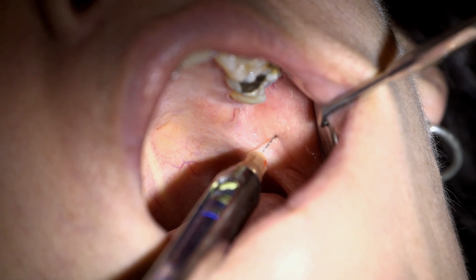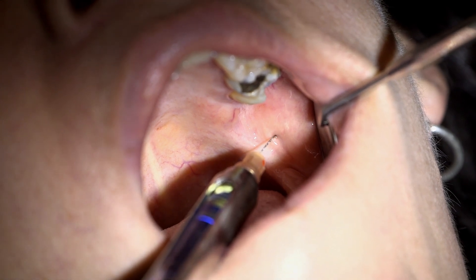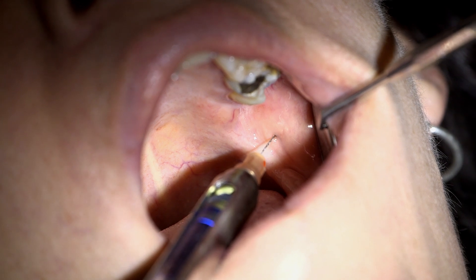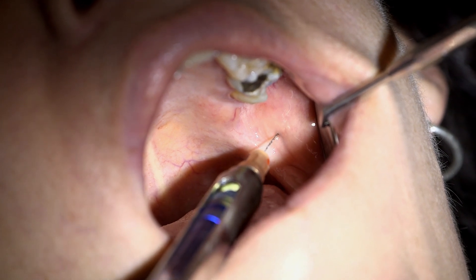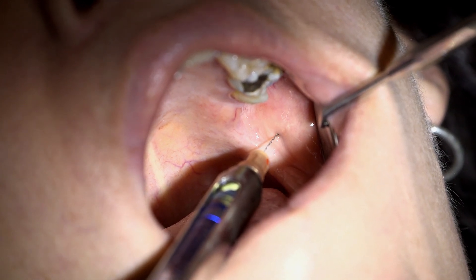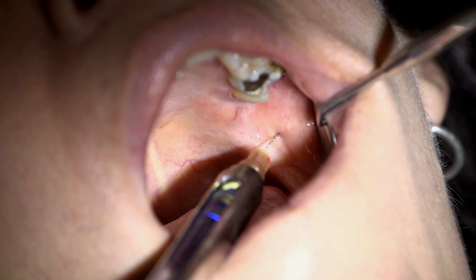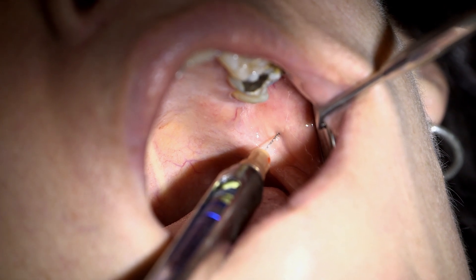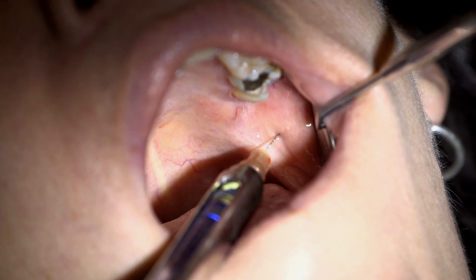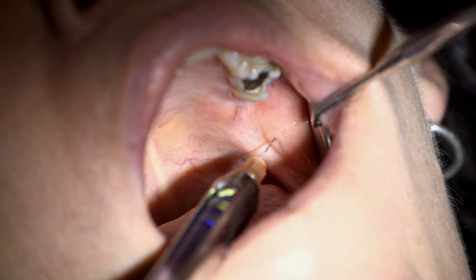Then aspirate, pulling back on the ring to ensure that you are not piercing the blood supply, and deposit the solution slowly. Carefully withdraw the needle.